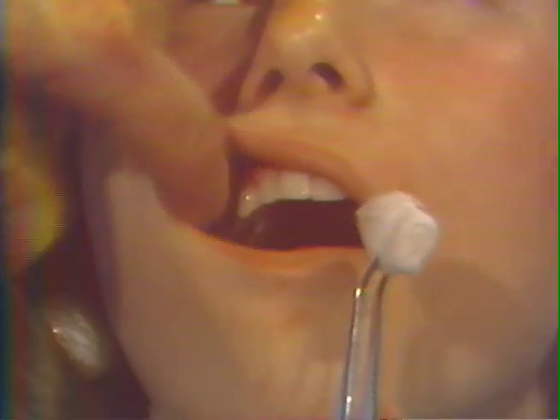I will now demonstrate the cotton roll placement for the anterior superior dental nerve, right side. Tip your head back just a little. Relax your cheek.